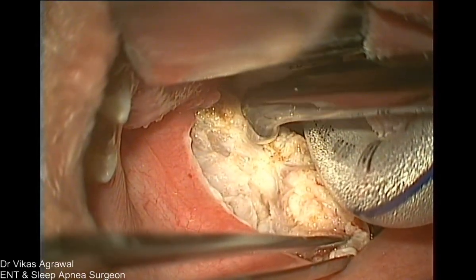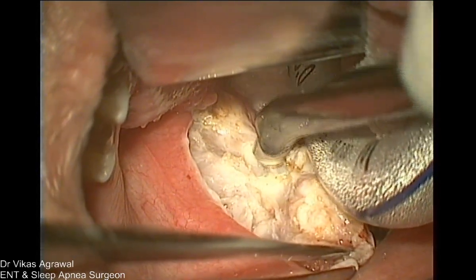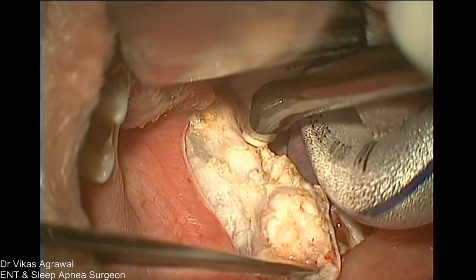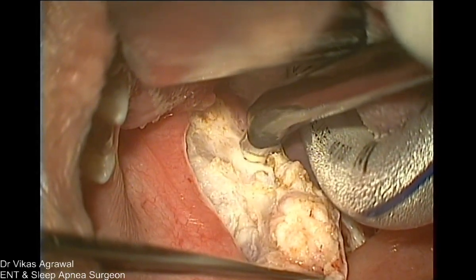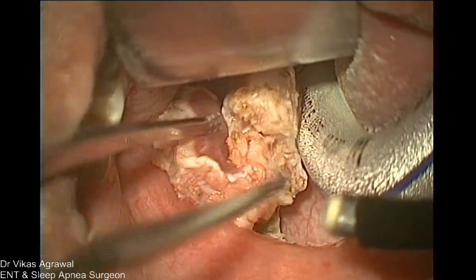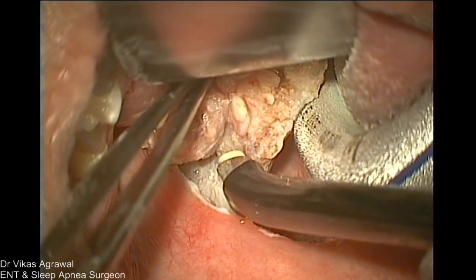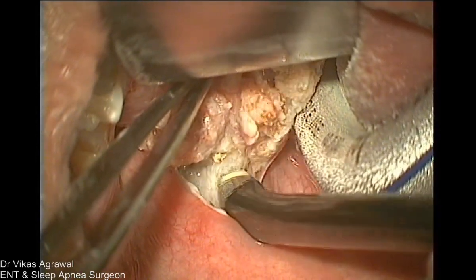Now here we have to make a plane into the posterior pillar. Can you see the muscle coming? Yeah. Rahul? Yeah. Seen very well. Correct. So this is our plane. Now if we look at this part, there is still a little bit to be dissected out here.